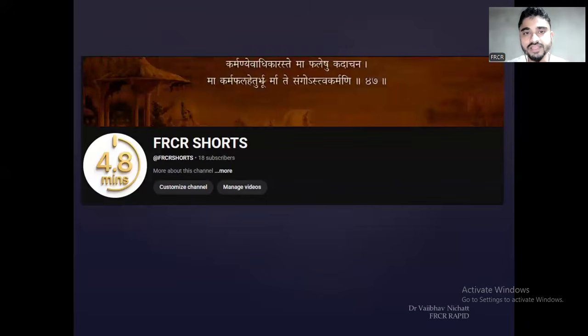So thank you guys, we have come to an end. We have covered all types of collapses, basically a short theory that will help you in your final FRCR 2B exam, how to identify each collapse, and what to write in the report as far as the shorts component of the FRCR 2B exam is concerned.